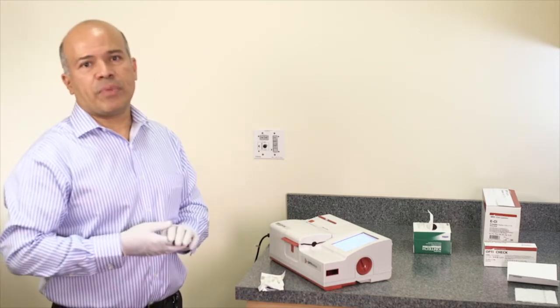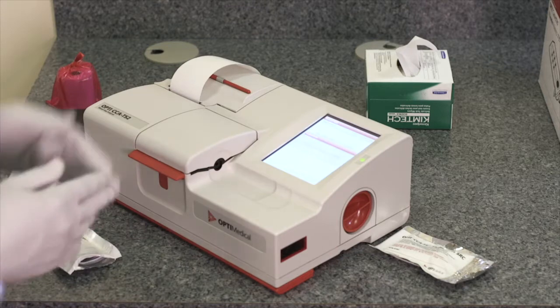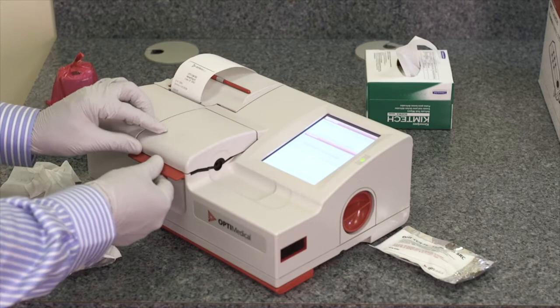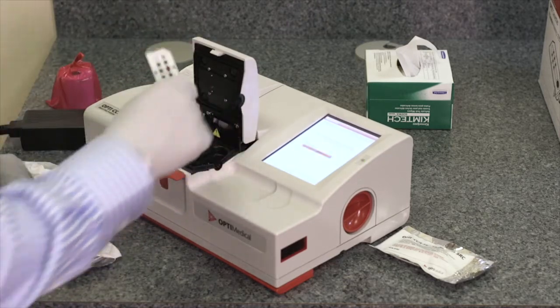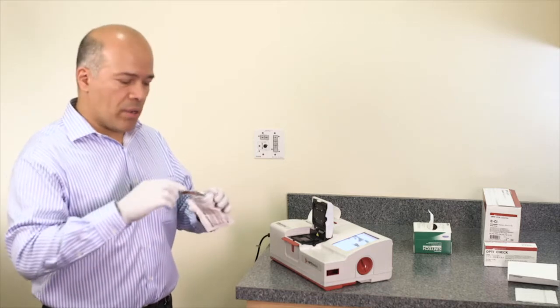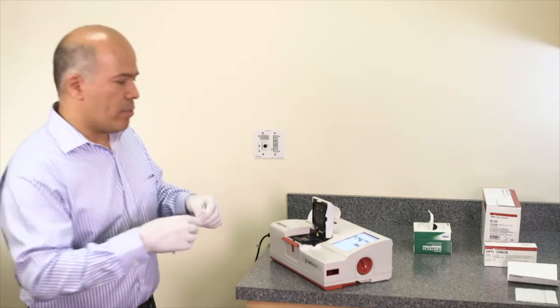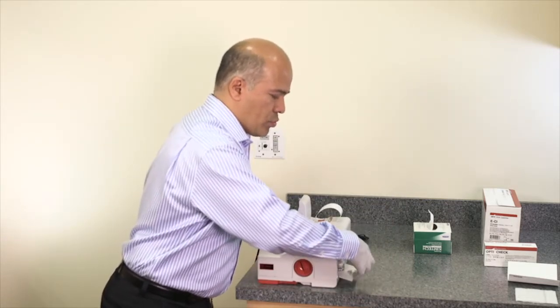At this time the test begins. When the total hemoglobin calibration is finished, the instrument prompts the user to remove the cassette. To remove it, open the cover, remove the cassette from the chamber, place the cassette back in the pouch, and store the cassette in the cassette compartment at the back of the analyzer for future use.